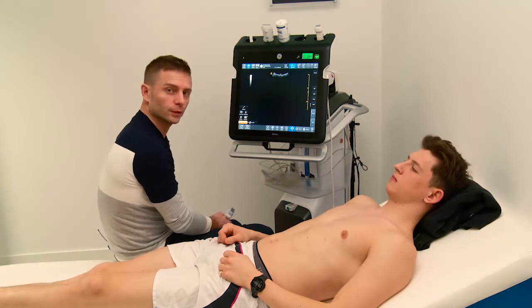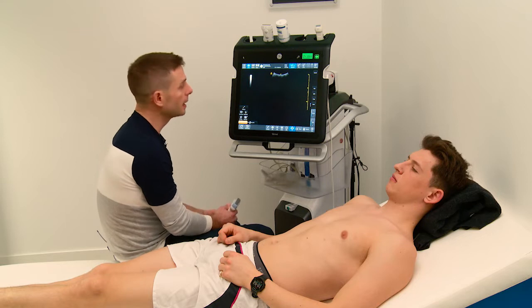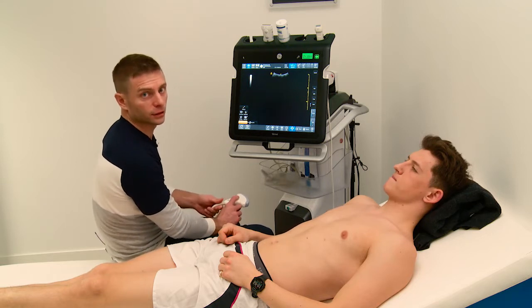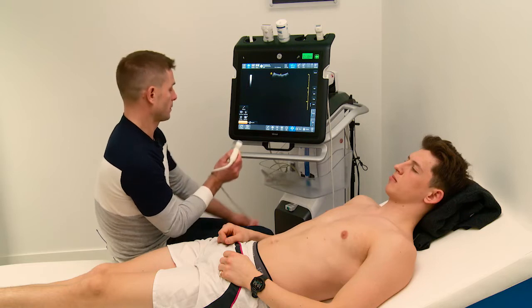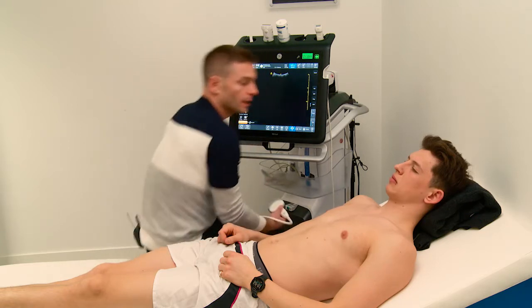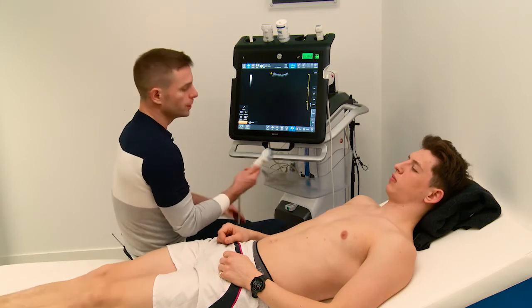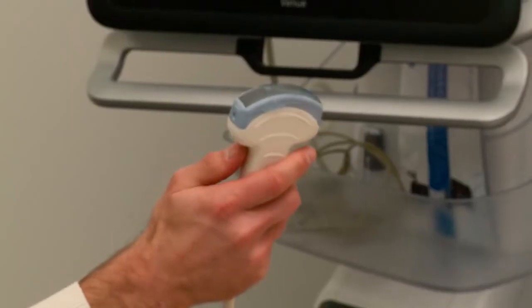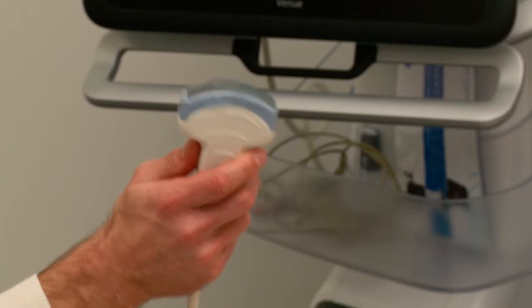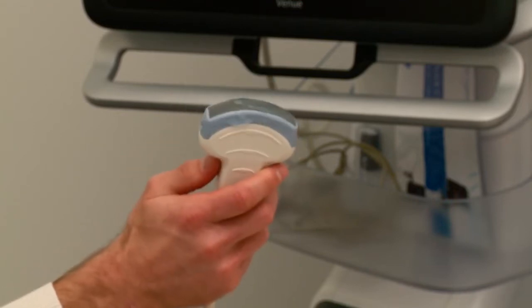Welcome to the FUSIC Lung Module. My name is Ashley Miller and I'm going to show you in this video how to do a basic lung ultrasound examination for an acutely unwell patient. First of all, we need to know what probe to use. The one probe which is best for overall use is the curvilinear abdominal probe.